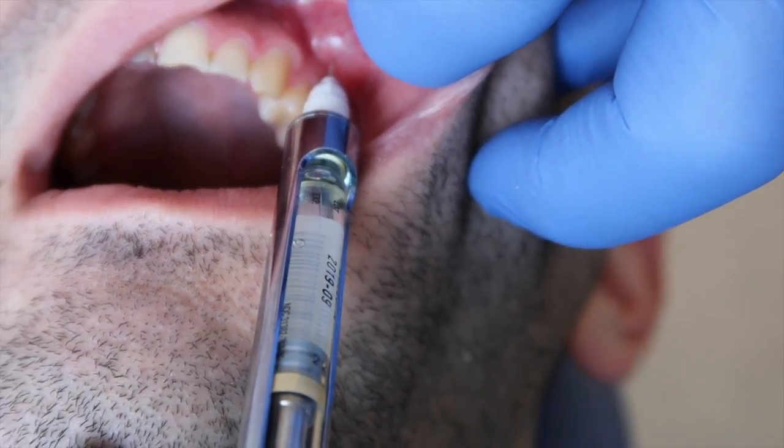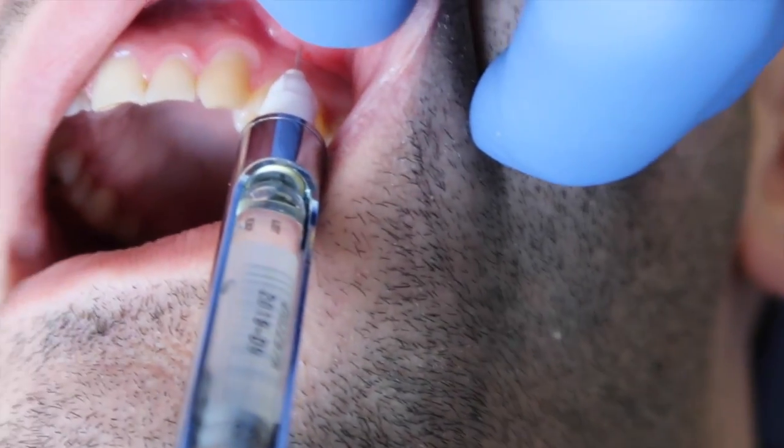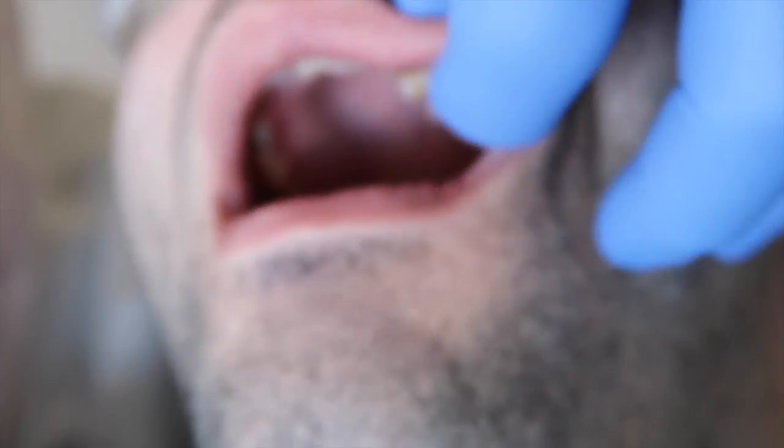Now, for the sake of not having Dr. Burpee anesthetized for the next hour, we're not going to inject the entire carpule — just for demonstration purposes only.